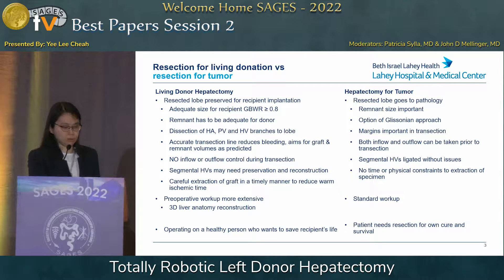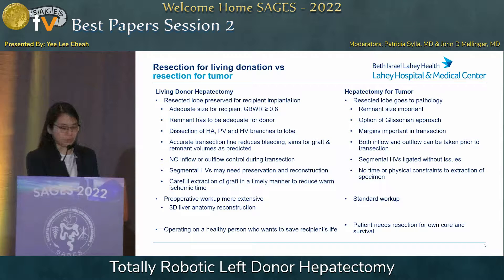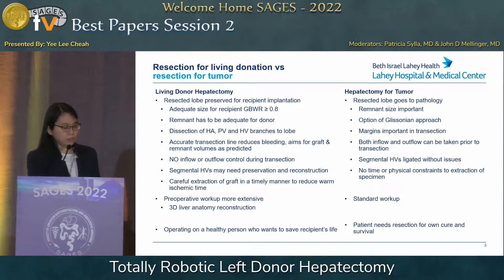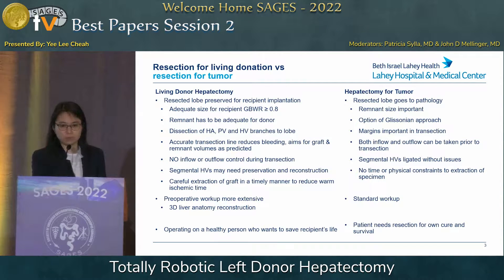No inflow or outflow control are performed during transection. There may be segmental hepatic veins that need to be preserved and reconstructed, and careful extraction of the graft in a timely manner is important to reduce warm ischemic time. The preoperative workup is more extensive than a resection for tumor. In our center, we use a 3D liver anatomy reconstruction. At the end of the day, we are operating on a healthy person who does not need this operation and is only undergoing it to save someone else's life.